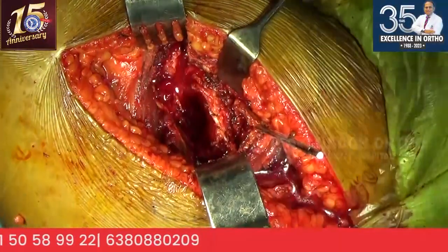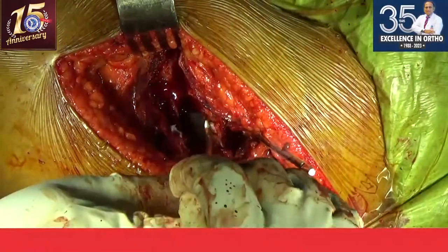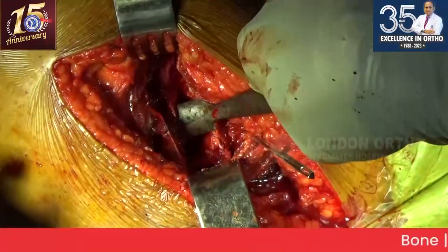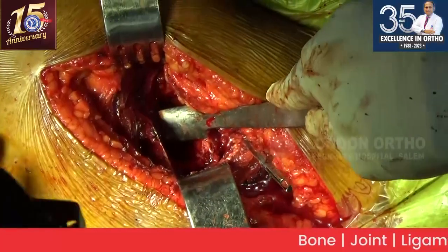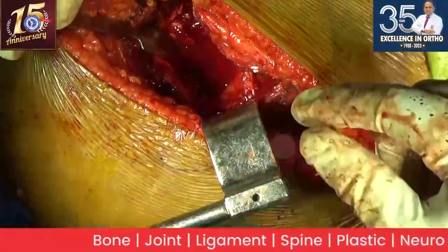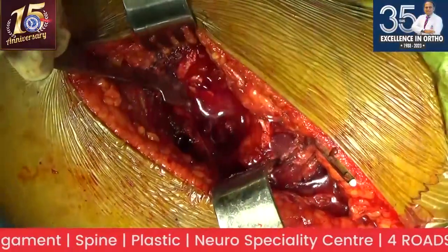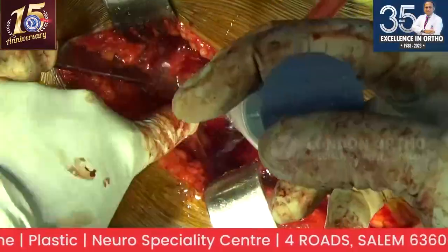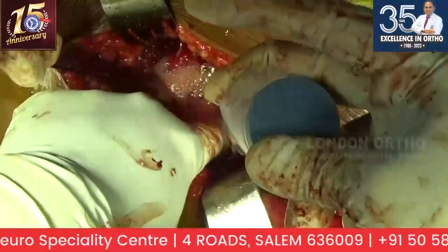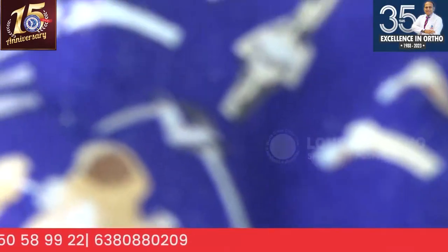Okay, so you take a Hohmann retractor, just put it on the medial wall and just walk along where it dips. You have your TAL, teardrops, all that. You should not push it too much inside. Internal iliac vessels are there for you. So, in a regular case, this will nicely open up. Here I am going to release the posterior capsules, I mean the capsules all around, with forceps for a better exposure.